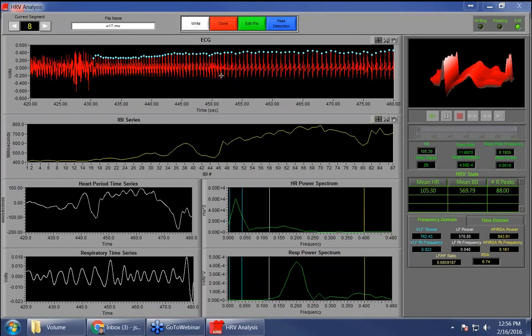And so if this were to occur somewhere around the middle, then you basically wouldn't be able to use this segment if you were considering deleting that portion out, because you're going to have some here and then you're going to have a bunch on the right side. So even to delete the first 31 seconds wouldn't be valid, because then we would only be left with 29.